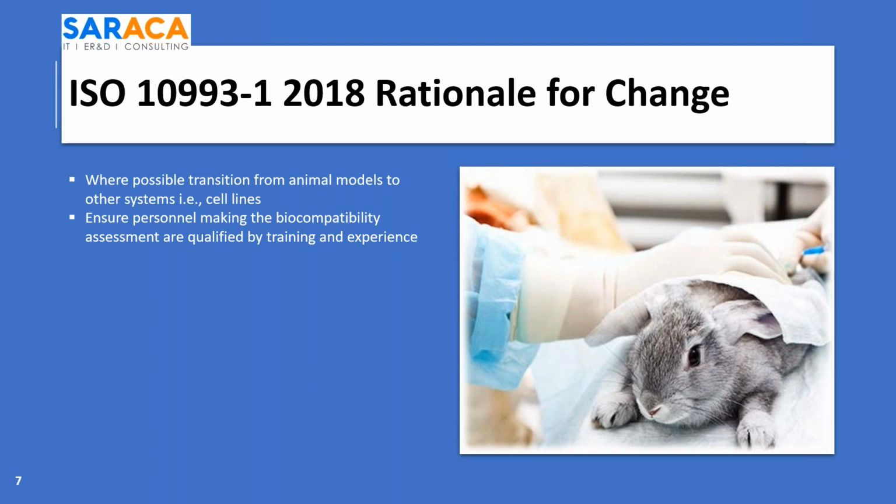The FDA also has a working group on using standard methods, which you should become aware of. This means instead of using pigs and pigs' veins, they're looking at alternate mechanisms for standardizing tests in an in vitro model, for example, using standardized models for veins and arteries, if they can be as consistent and mimic the use of the device within the body. It's a good group to get involved with, and these standards will be coming along as they perfect them.